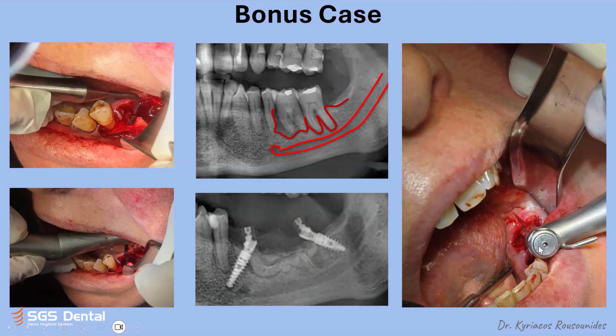It's almost parallel to the jaw. This is 60 degrees. That's why the 45 degrees angulation of this multi-unit is not exactly at the level that I would like it to be. It's a bit more. We still augmented the area, and I'll explain how we augmented this area.